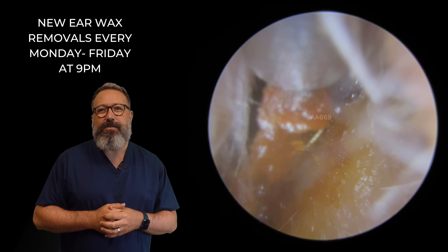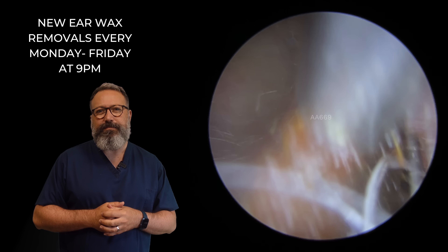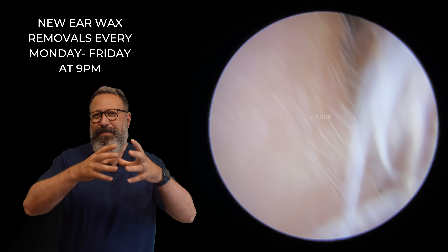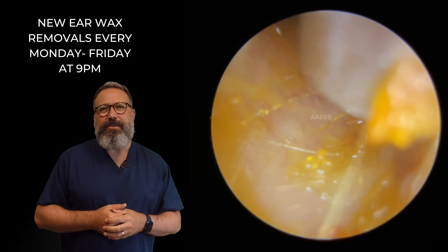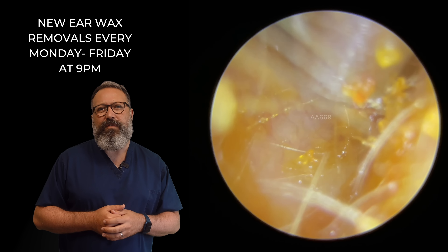And we're just going to slowly ease back on this, take this out. There we go — out that comes. You can see quite a flat and angular piece. These are the bits that have been stuck to the sides of the canal wall. Just going to take some of these looser bits off the side. There we go. You can just see to the right-hand side this little bit tucked around the corner. Let's lift this off.